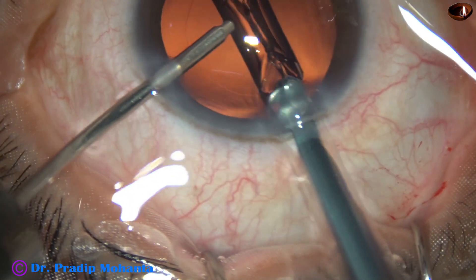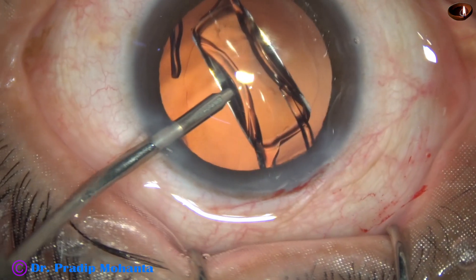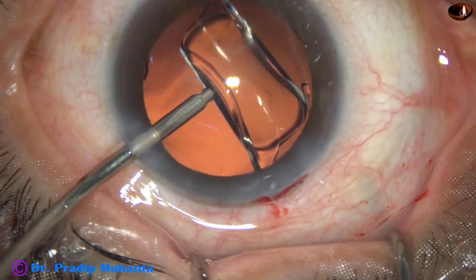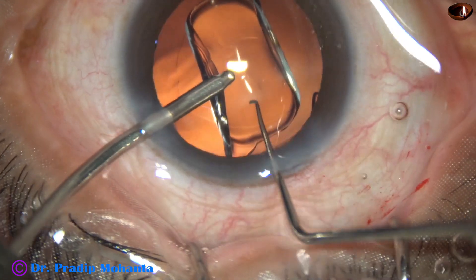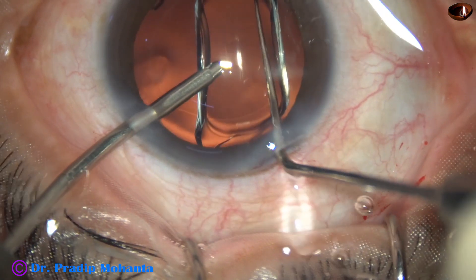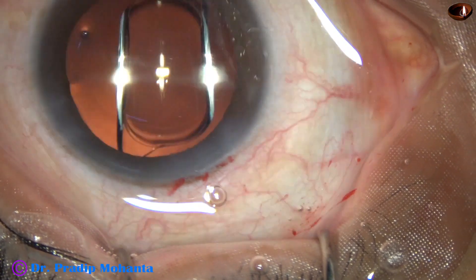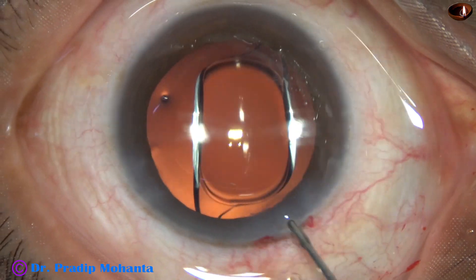The irrigating probe lifts the anterior lip of the main wound and thus the anterior chamber is maintained. This is a hydrophobic acrylic single-piece monofocal intraocular lens. It has been implanted keeping the anterior chamber formed by irrigation — this is called hydro-implantation. The haptics have gone into the capsular bag. This lens unfolds slowly.